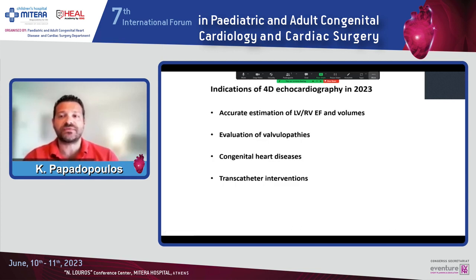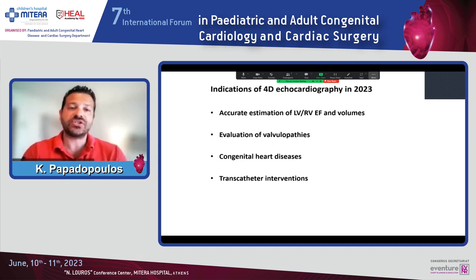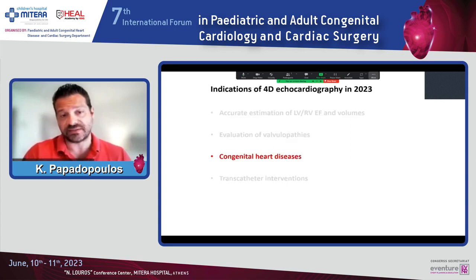So what are the indications of 4D echo in 2023? Of course, accurate estimation of the left ventricle and the right ventricle volumes and ejection fraction, evaluation of valvulopathies, congenital heart diseases, and transcatheter interventions, a very important field.